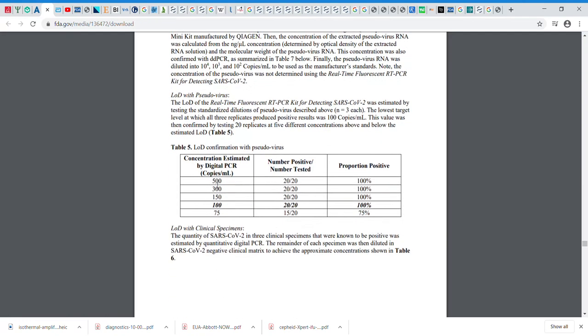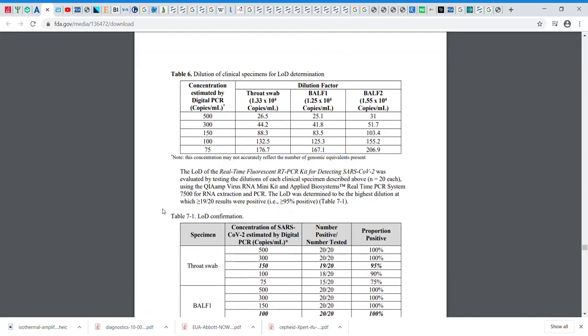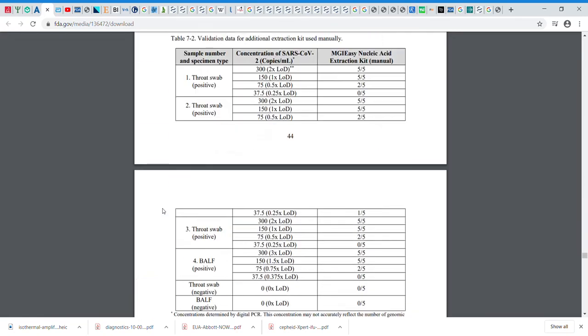They talk about limit of detection, 100, and they're still pretty good at 100. Remember the Abbott test with 125? It didn't really work at 125. They only tested on 250. This is pretty good. They go into a lot more detail.